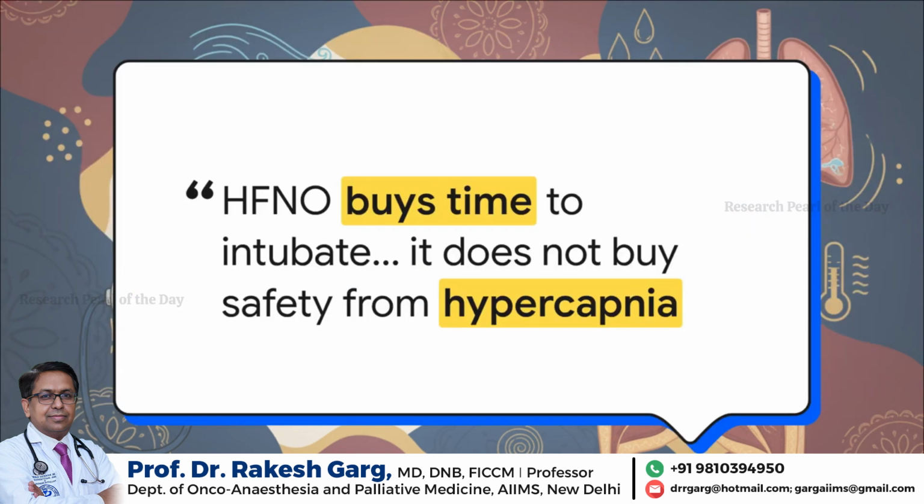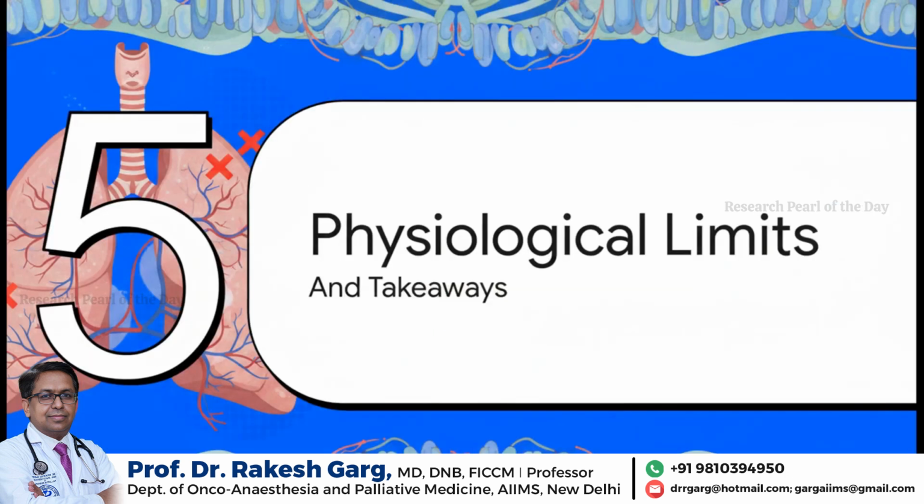There is a quote that perfectly hits the nail on the head regarding this dynamic. It's basically the anesthesiologist's bottom line. HFNO buys time to intubate without desaturation. It does not buy safety from hypercapnia or acidosis if apnea is prolonged. Stopping someone from turning blue does not mean you've stopped the silent, creeping threat of toxic carbon dioxide accumulating in their blood. Which brings us to our final part, Section 5, Physiological Limits and Takeaways.